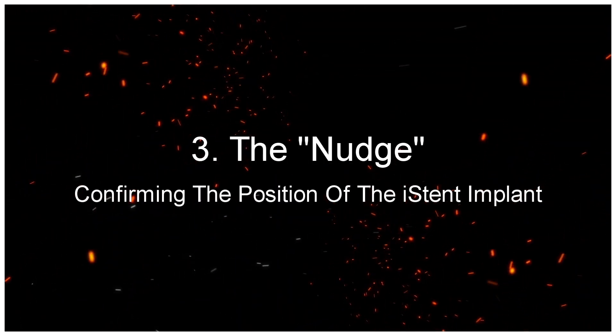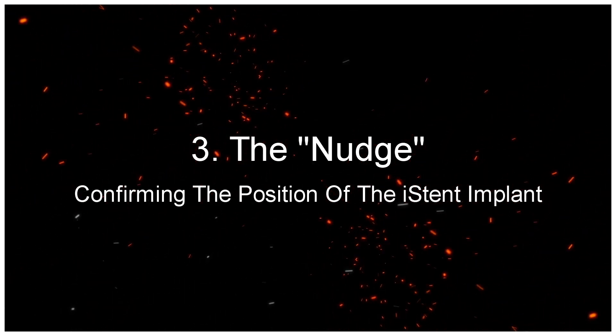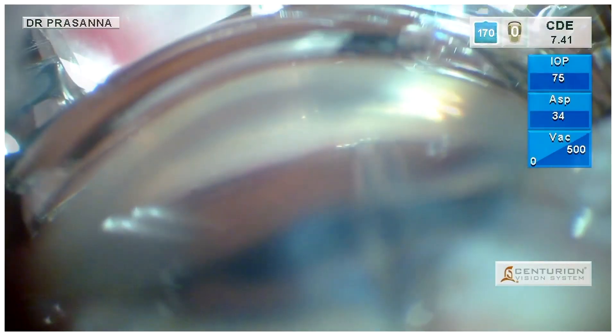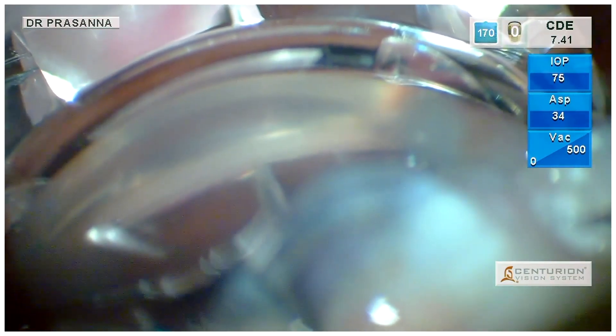The Nudge: confirming the position of the iStent implant. Here we have another case of the G1 iStent which is being implanted into the angle with a proper gliding technique.